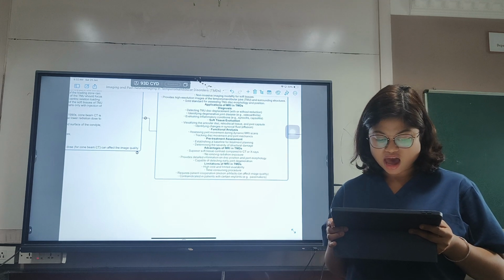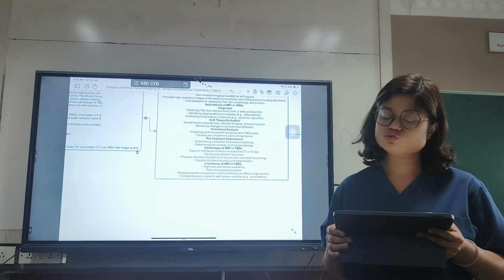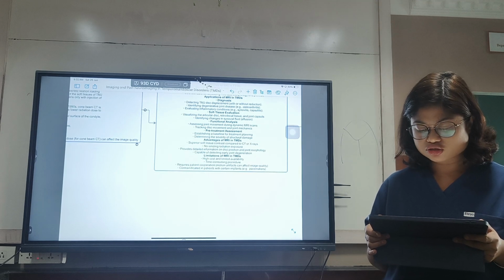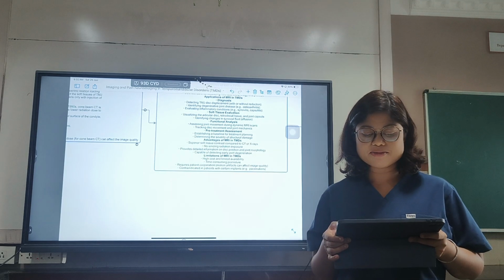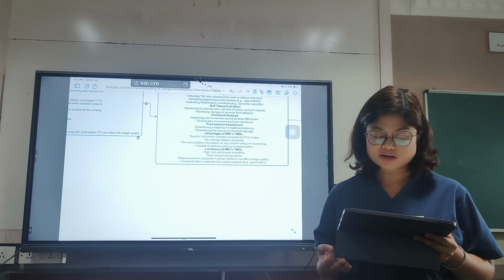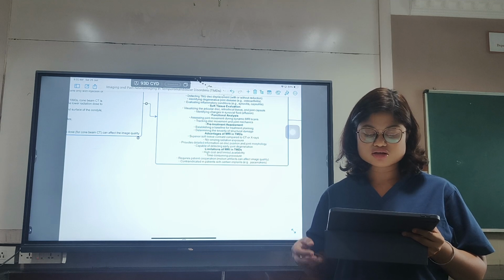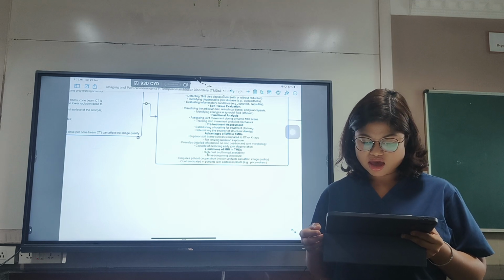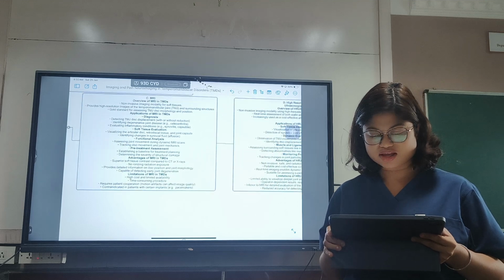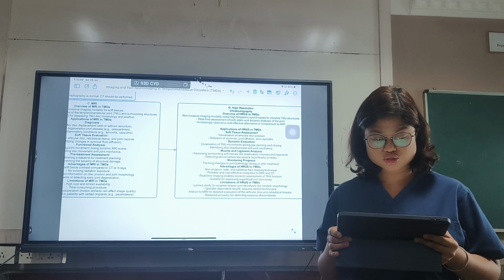Advantages: superior soft tissue contrast compared to CT or X-rays. No ionizing radiation exposure, provides detailed information on disc position and joint morphology, and is capable of detecting early joint degenerations. Limitations of MRI: high cost and limited availability, a time-consuming procedure, and it requires patient cooperation so that motion artifacts are not present, as they can affect the image quality. It is contraindicated in patients with implants and various pacemakers.